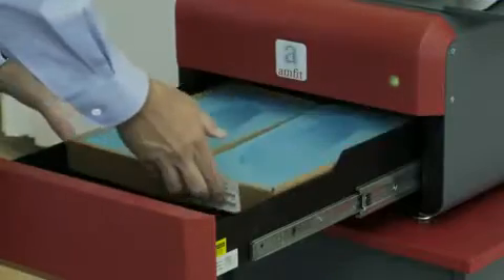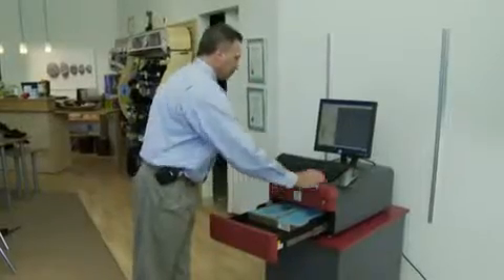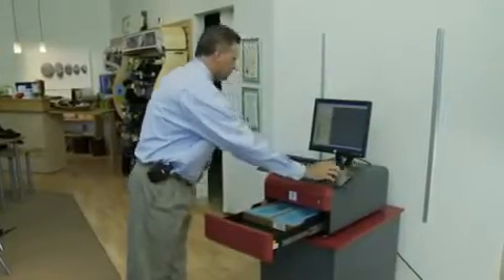Model your patient's feet using the standard impression techniques. Then, place the foam box inside the tray and press the scan button. In less than a minute, the Impress Scanner's unique laser device quickly and accurately scans both the right and left foot contour of your foam box.